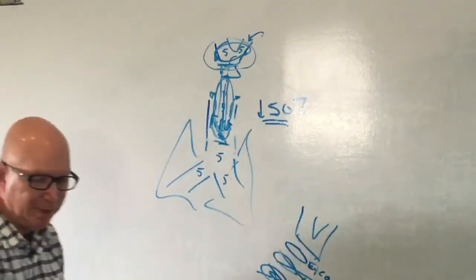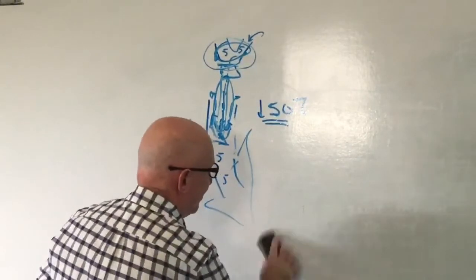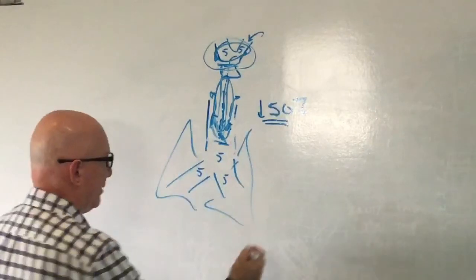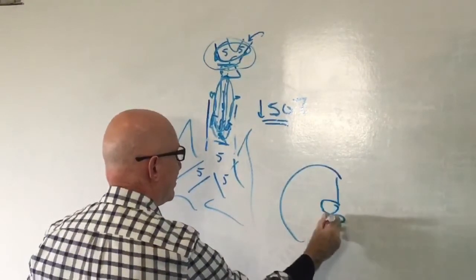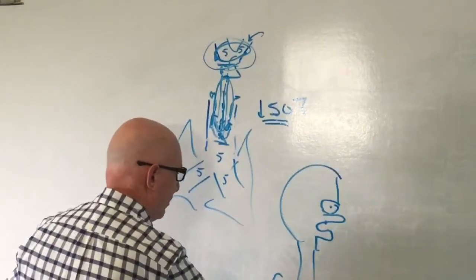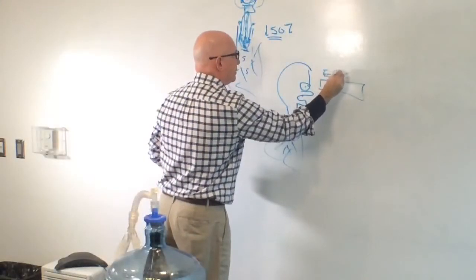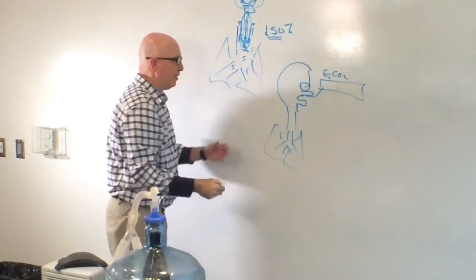And I think that probably the best way to understand this completely is to look at this particular model or diagram. So you have Homer Simpson here, and you have an end-tidal CO2 monitor out here, and you're sampling gas from the mouth through your end-tidal CO2 monitor.